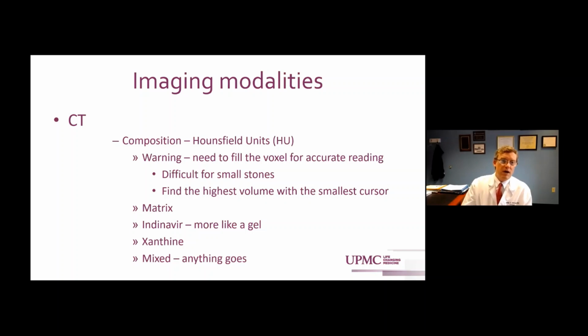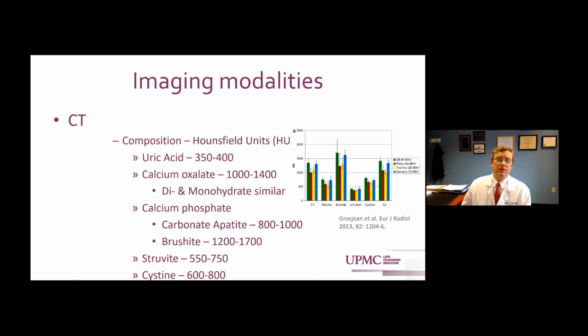Xanthine stones, people talk about, that are difficult to see, but I've never seen one, and I've been doing stones for 30 years, so not sure. Also mixed stones, of course, when we're talking about composition, really anything goes at that point. So you could have almost any Hounsfield unit number. But here's at least the composition clues you can get from pure stones, or mostly pure stones.